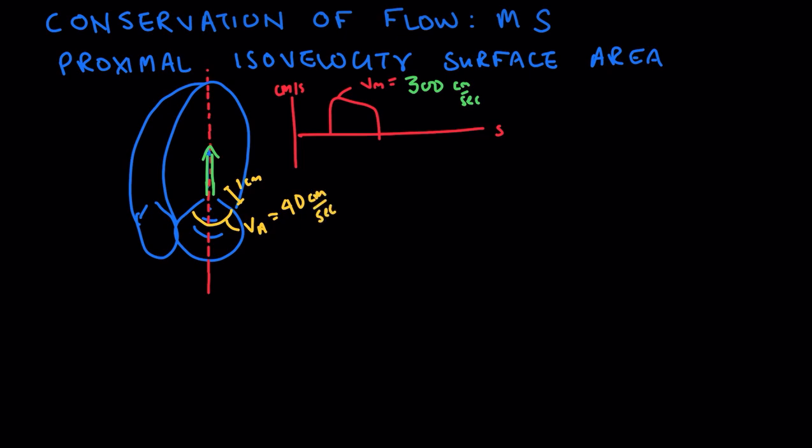Okay, so we have a couple different parameters, namely of the blood as it comes towards that stiff valve and then as it leaves the stiff valve. How do we use that to solve for area? Well, let's set up our equation here. We know that the flow coming towards the stiff mitral valve is equal to the flow right through the leaflets at that stiffest point.